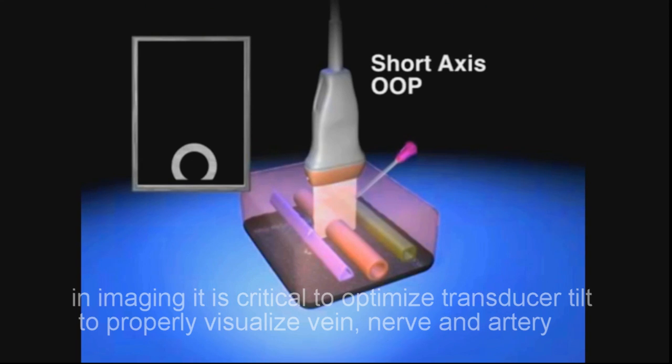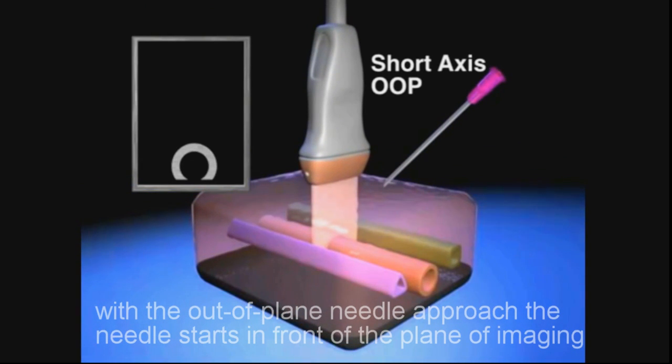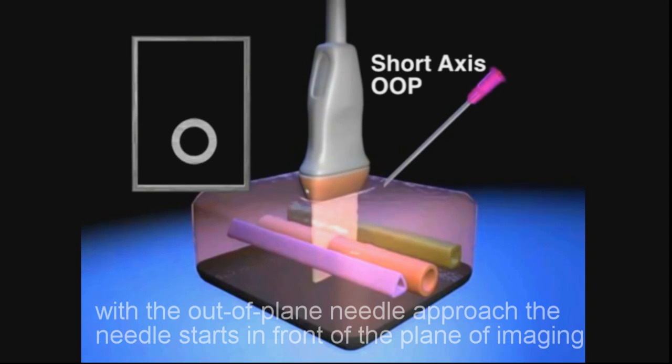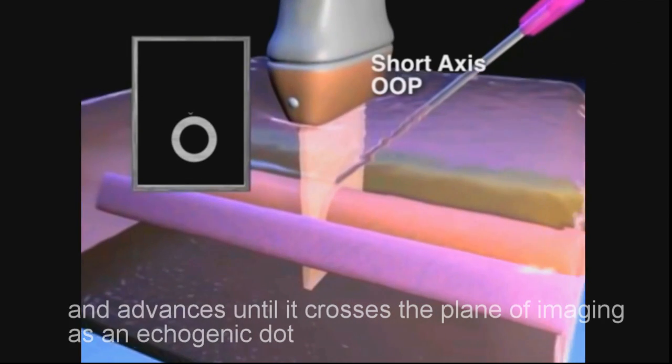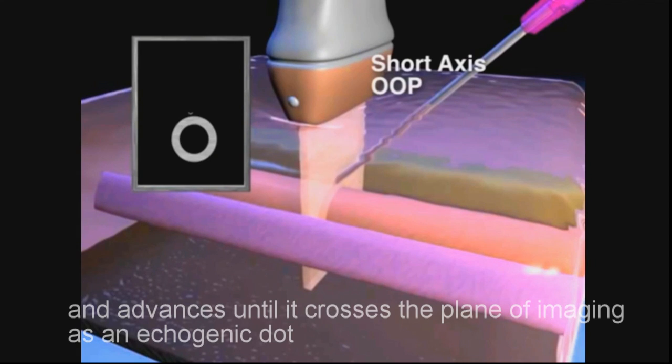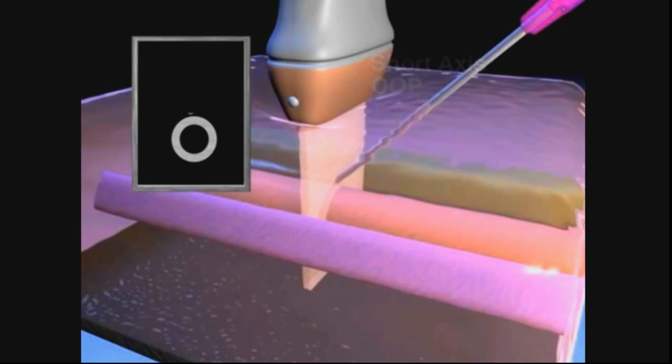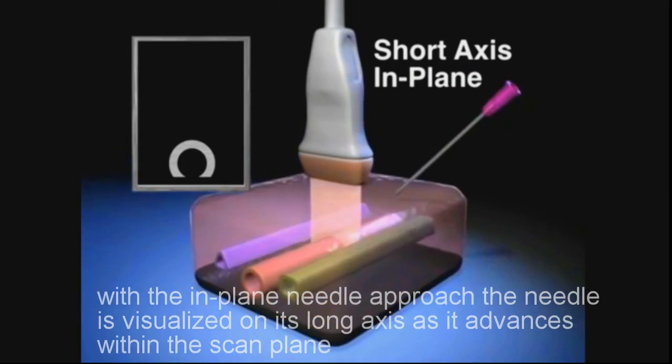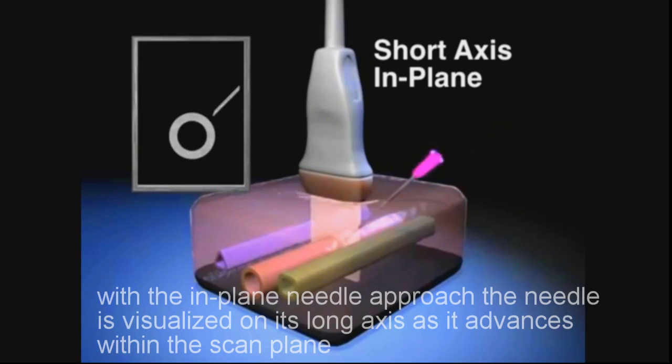With the out-of-plane needle approach, the needle starts in front of the plane of imaging and advances until it crosses the plane of imaging as an echogenic dot. With the in-plane needle approach, the needle is visualized on its long axis as it advances within the scan plane.